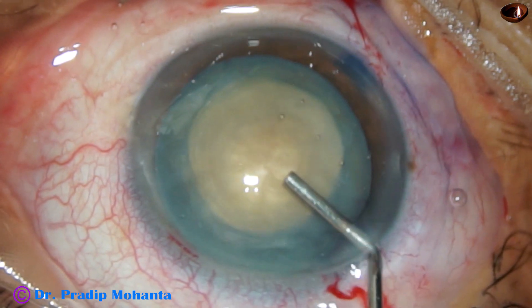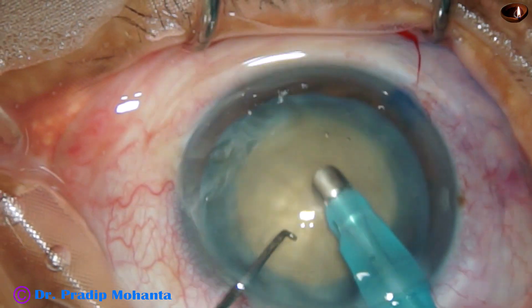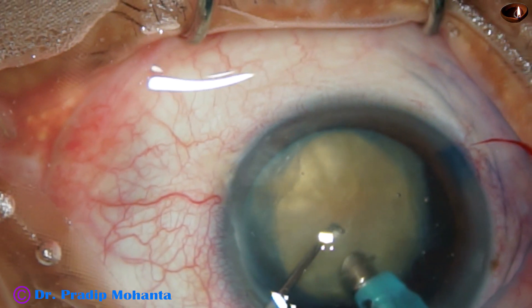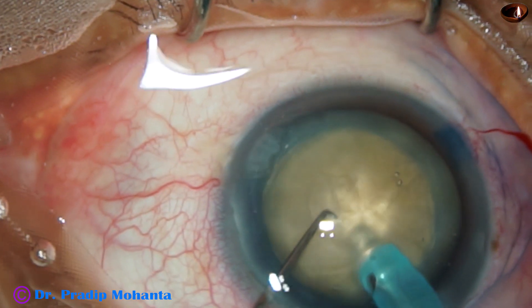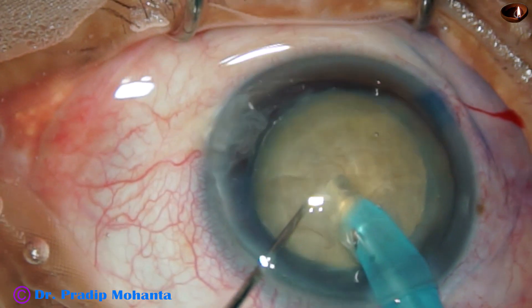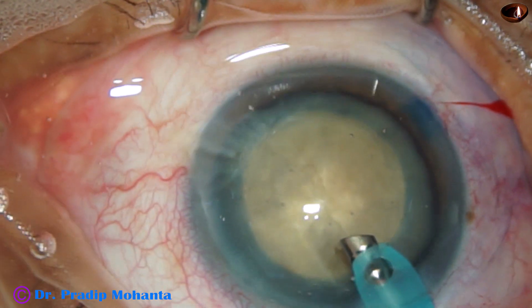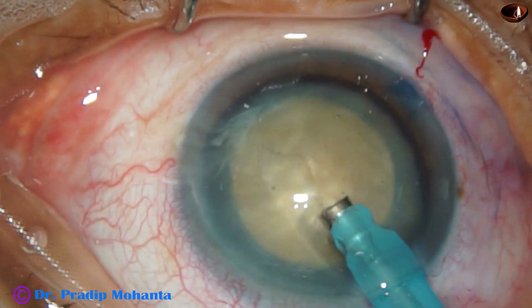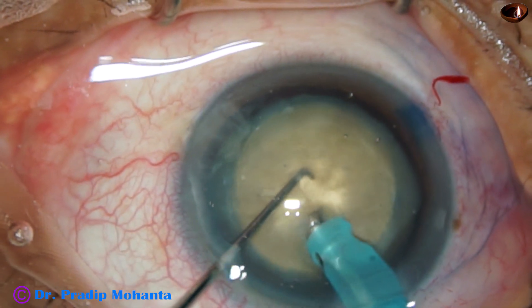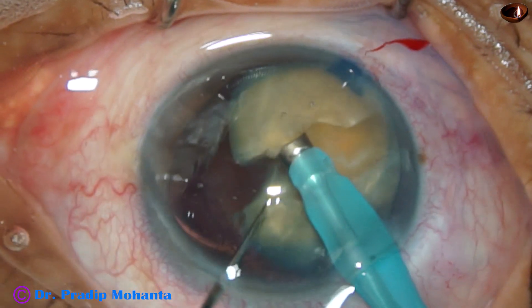Visco is again injected and now is the time to introduce the phaco needle. This nucleus is free-floating. It is very difficult to bury the tip of the phaco needle with bevel up. So I go into the substance of the nucleus bevel down and make a tunnel. And now I use reflux and come out. I turn the handpiece, make the bevel up because I find it easier to divide the nucleus with bevel up. And now, this is a nice crack.